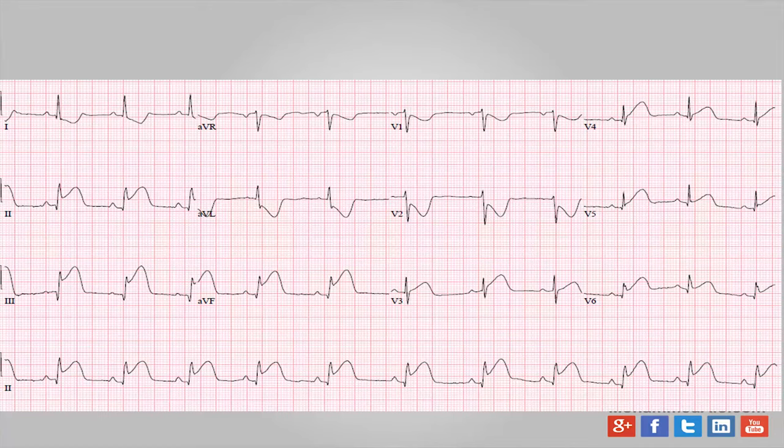The next EKG here is your basic ST elevation MI. If you look at leads 2 and 3, you see elevations. You look at V2 and V1, you see depressions. Remember, nothing reciprocates there. Ischemia does not localize. Those are not reciprocal changes. That's a posterior MI because you have an RCA infarct, and that feeds the posterior wall as well. AVL is depressed. Inferior leads always reciprocate to AVL and 1.